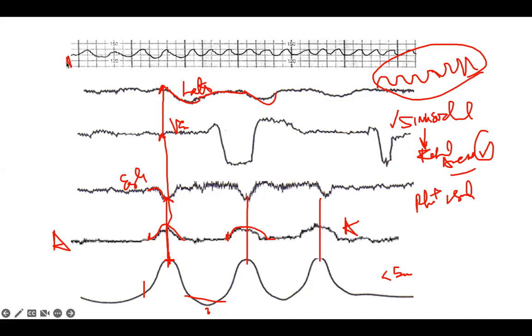All of these bad ones are category 3. Okay, I don't want to bore you too much about them. Usually they don't ask you to list them, but category 3 ones are those with recurrent late deceleration, and recurrent variable deceleration, and sinusoidal. Those are the 3 ones, category 3. You have to worry about it. Okay, so this is the end of it.